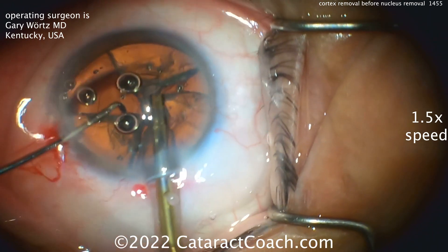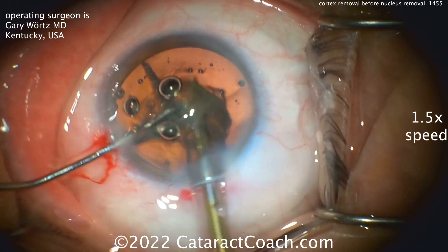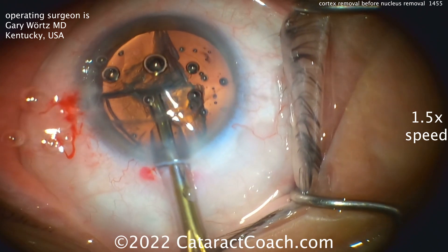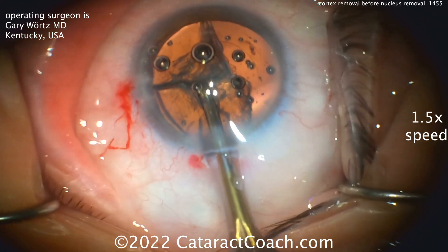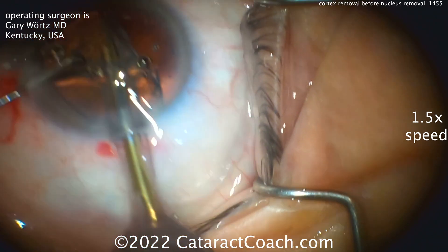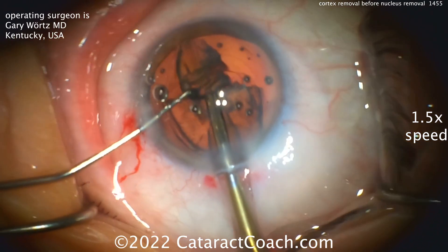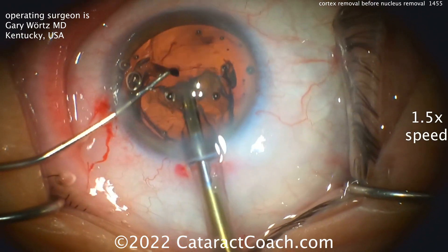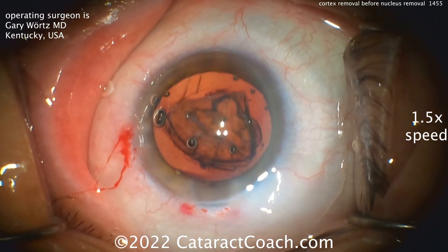Using the phaco probe — here's the chopper — buzzing into that one quadrant, comes out pretty quick, pretty easy. There it is. And then here comes another quadrant. Just wiping the ocular surface here. Chopper going back inside the eye. Another quadrant's coming out. And look — the capsular bag is completely empty. Really nothing left in the bag except for that nuclear piece. But all the cortex has already been pre-removed using that technique.